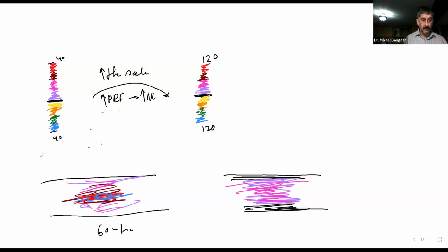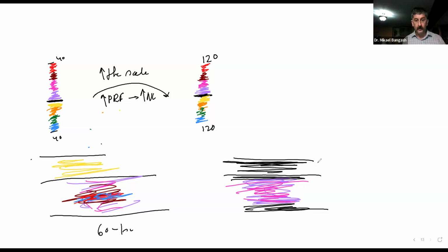We might have had another vessel next to it where we would have had a relatively negative Doppler shift but low velocities. That is going to disappear.